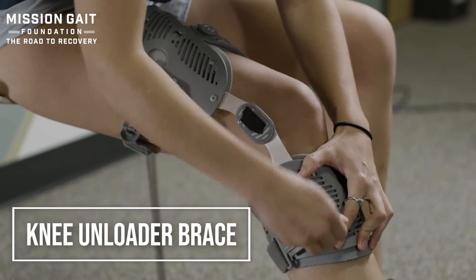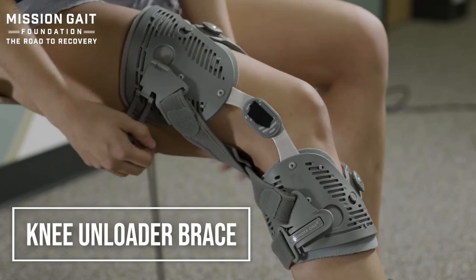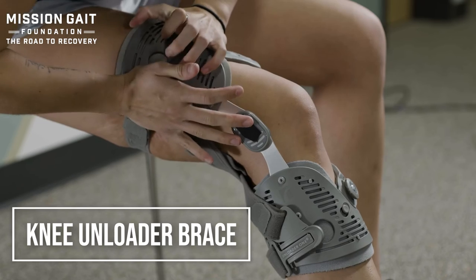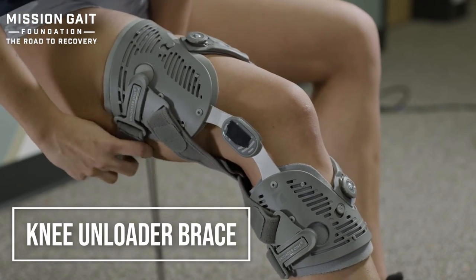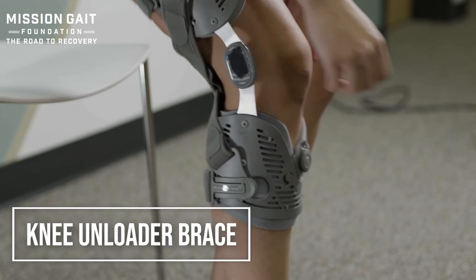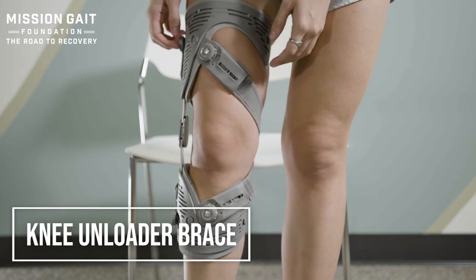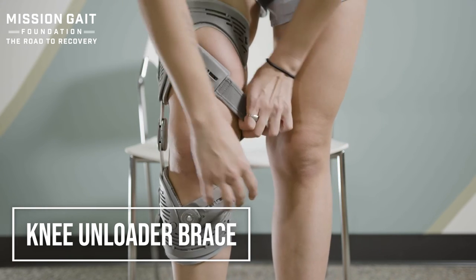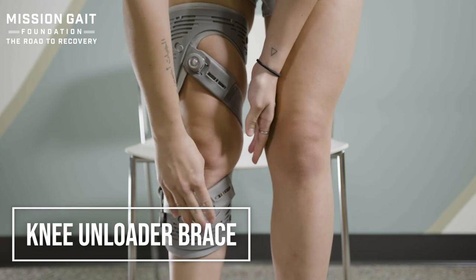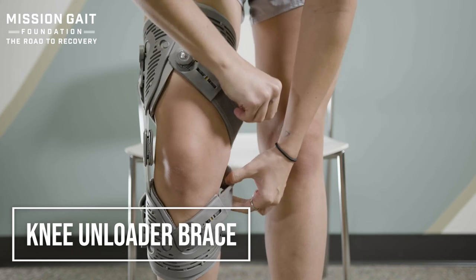The next brace is an unloader brace, really for somebody with arthritis in the knee — specifically compartmental arthritis. It's usually medial, though it can be medial or lateral compartment arthritis, and you want to decompress or take pressure off. This particular brace is a unilateral-sided brace used to decrease compression on the medial compartment. These can also be bilateral upright devices with an upright on both sides that sandwich the knee. She's strapping the top and bottom, getting it up to match the knee joint line, then snapping the strap into place to hold securely.